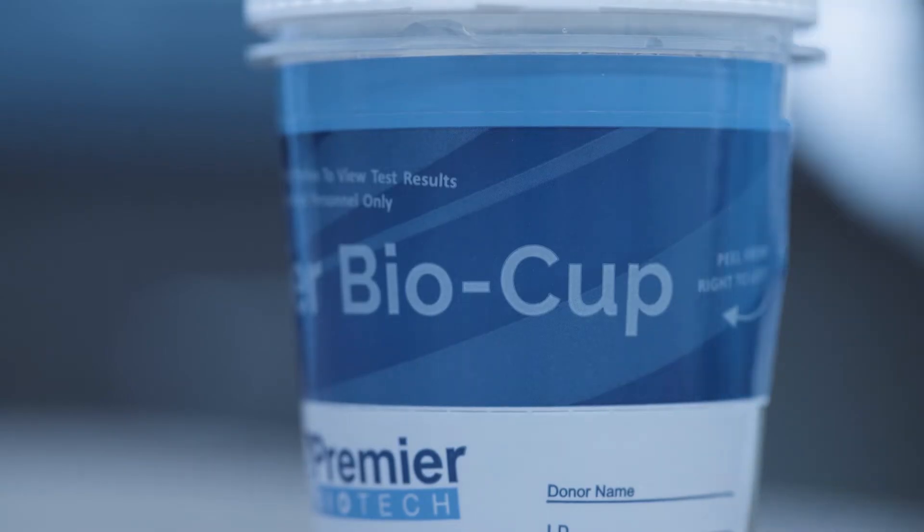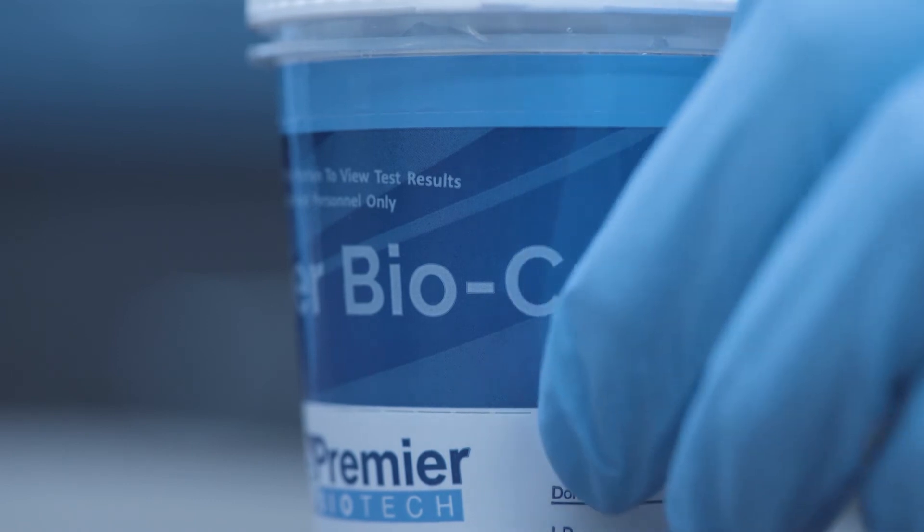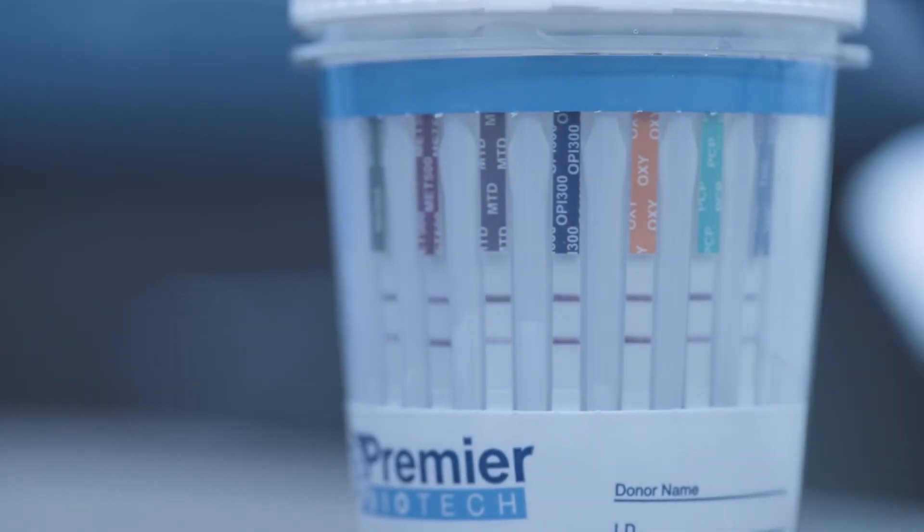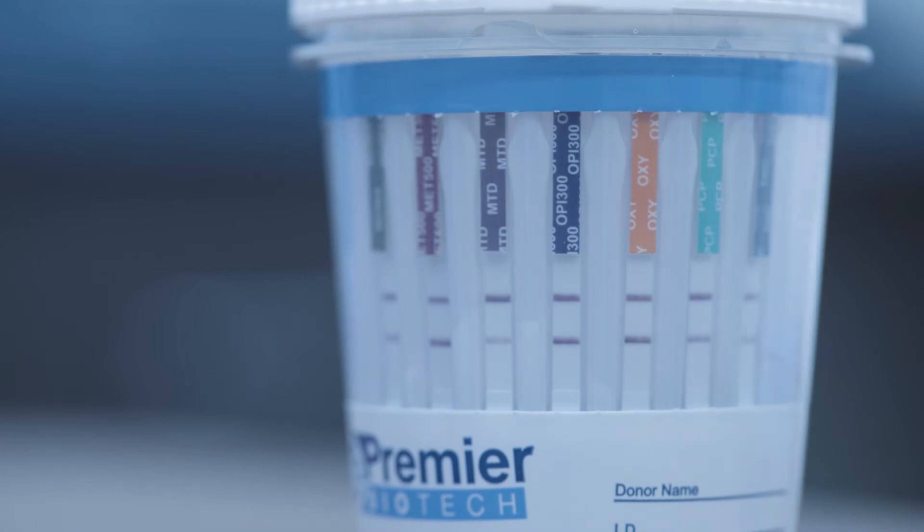Next, peel off the privacy label. The Premiere BioCup tests for one drug per strip. This makes the test easier to read, as each strip contains its own control and test line.